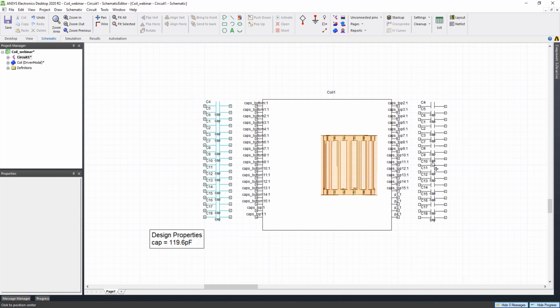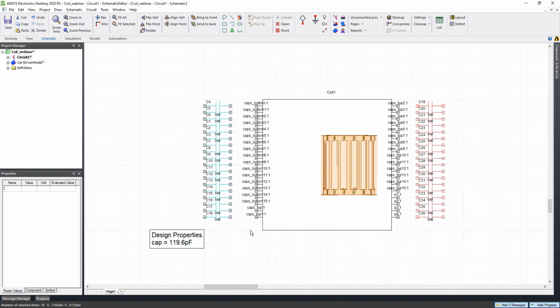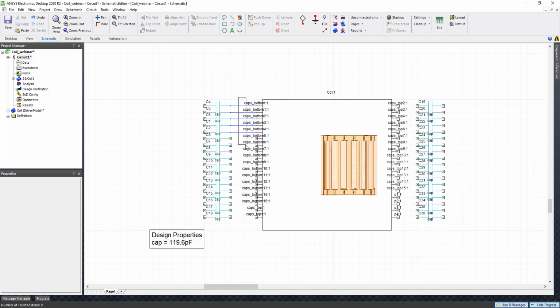The good thing about setting up this variable is if you have the design parameters here, then you are able to run the parametric analysis. So you can actually tune your capacitor values up and down to see how it changes, etc. I should also copy the wire. But yeah, this can be simple. Let's copy it. Copy, paste, paste, paste. Okay.